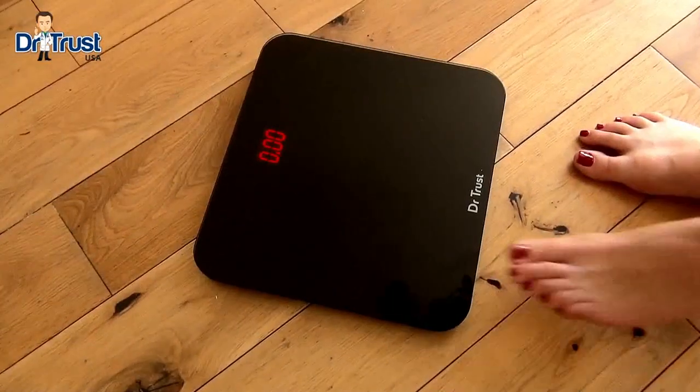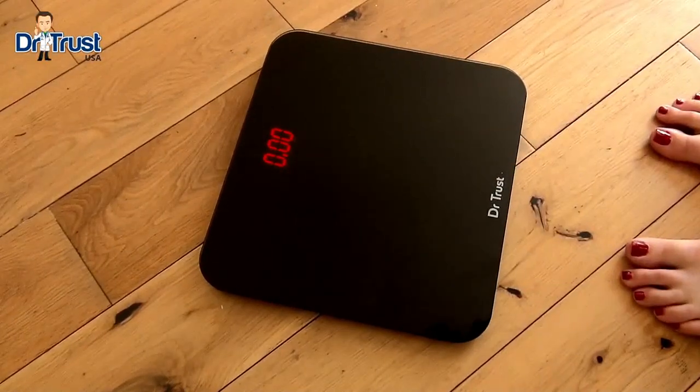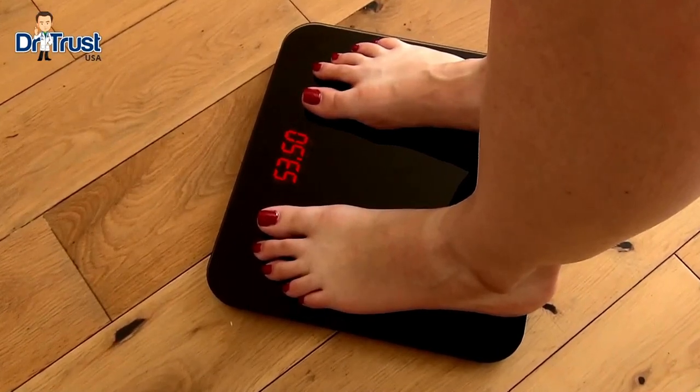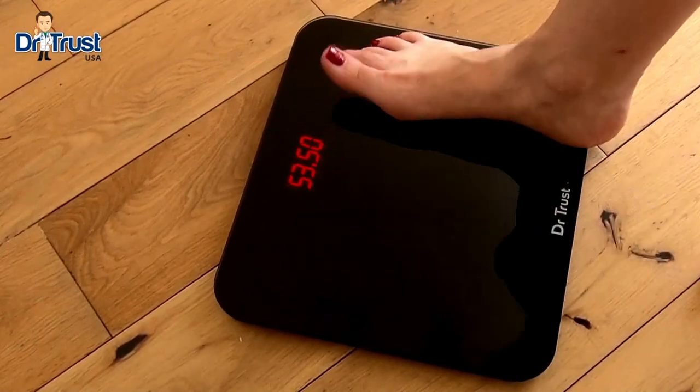To get started, place the scales on a hard, flat surface and step on and off again to initiate calibration. When the scales show zero, step on and stand still with your weight evenly spread across both feet. The display remains steady when an accurate measurement has been taken.